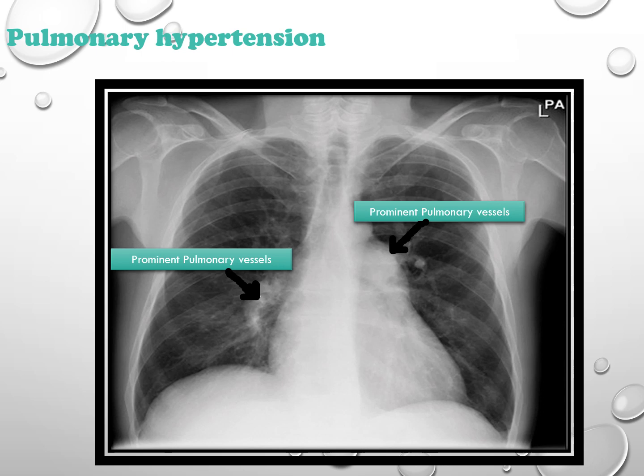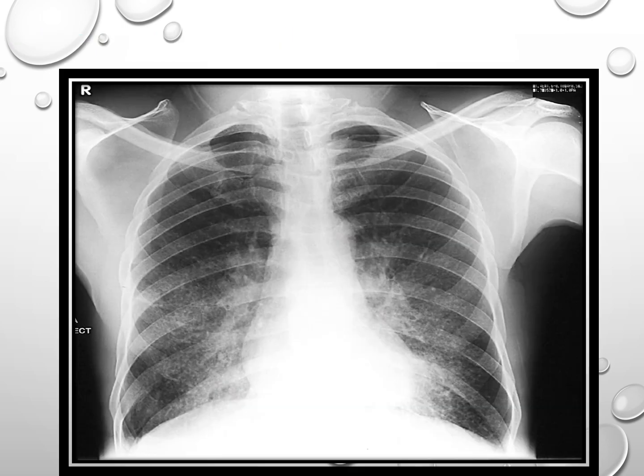This x-ray reveals signs of pulmonary hypertension, notably characterized by the enlargement of central pulmonary arteries. Additionally, it shows cardiac changes attributed to right ventricular enlargement. This x-ray shows bilateral interstitial pneumonitis, a condition frequently associated with mycoplasma pneumonia.